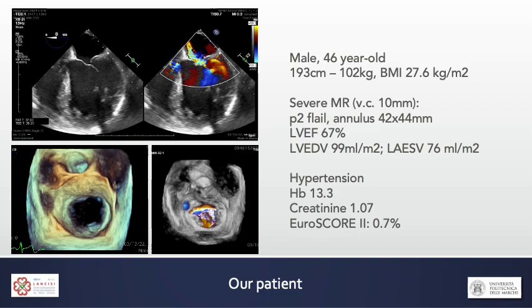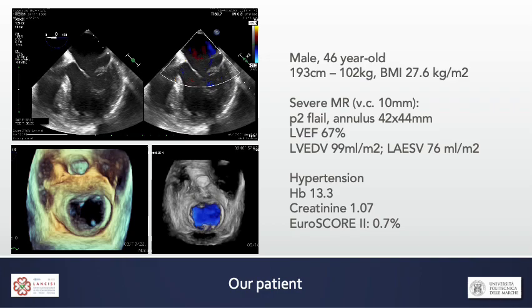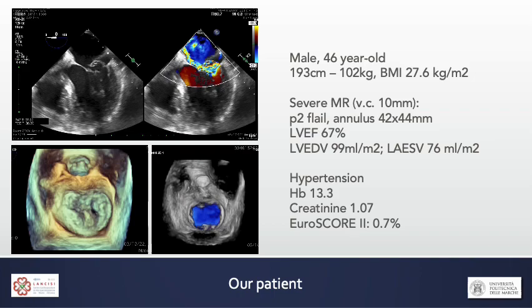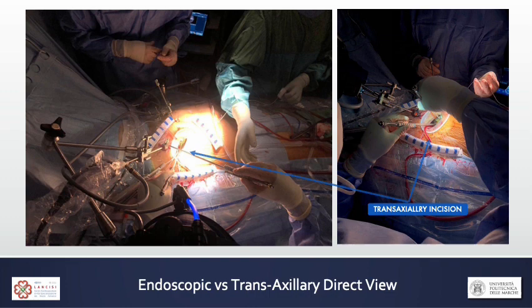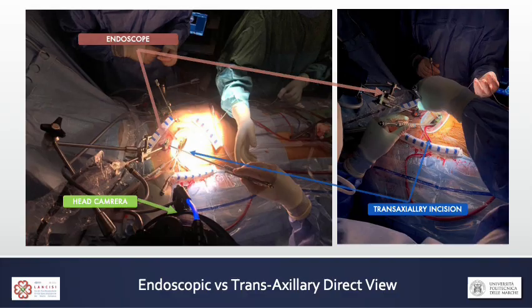This is the case of a young man affected by severe mitral valve regurgitation due to a P2 flail. He had no relevant cardiovascular risk factors apart from hypertension and had good ventricular function, so he was a low risk patient. Although we never use an endoscope, in this case we placed one to show and compare views between the head camera and the endoscope.